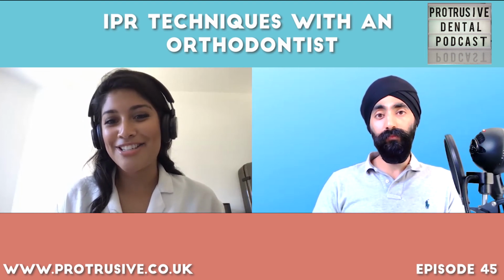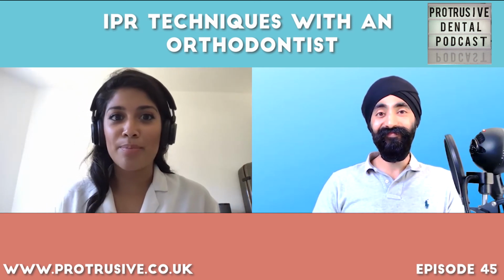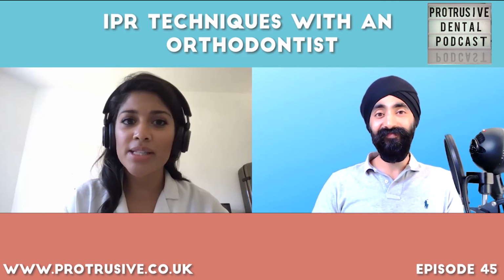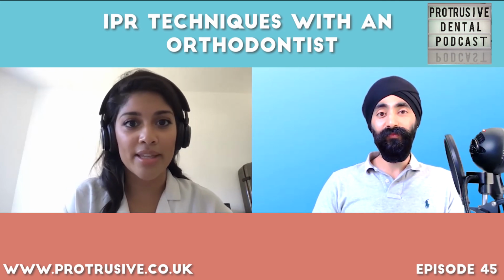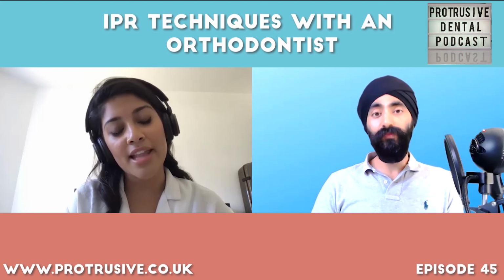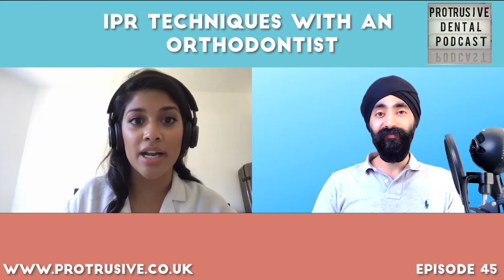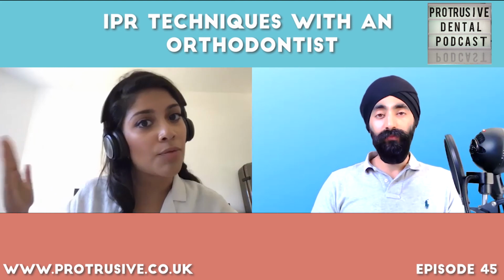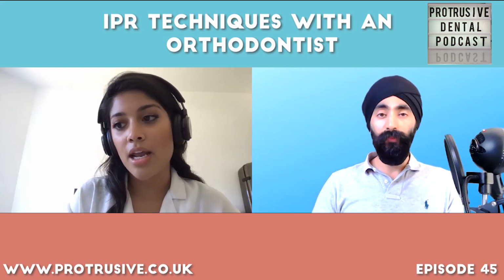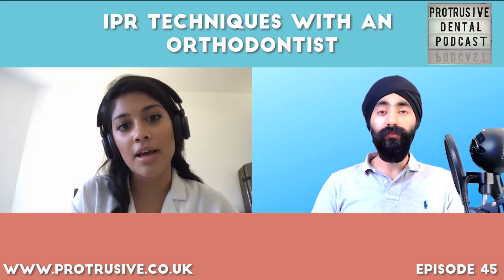With fixed treatment, you're in niti wires, the teeth are tipping everywhere. I'm sure if we actually put that on a ClinCheck, we would see a bit of forward back movement. But with Invisalign, the beautiful thing about it is you can digitally see where the teeth are going to go. So because of that foresight, you can plan for it not to happen. And that's why I love the superimposition tool, because I specifically say to Invisalign, unless my teeth are retroclined and I can afford for them to come forward a little bit, do not procline the lower incisors. And then if there's too much IPR, lower 3 to 3, I'll take it back to the premolars. Premolars are bulbous. You can afford to do that.